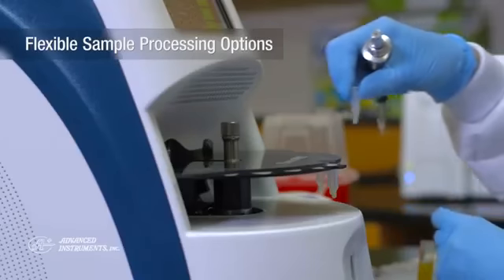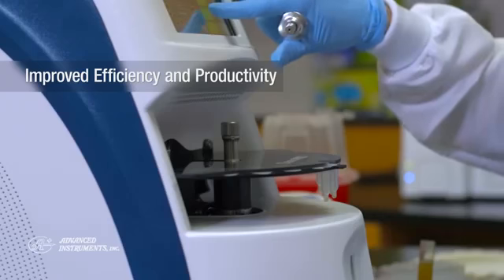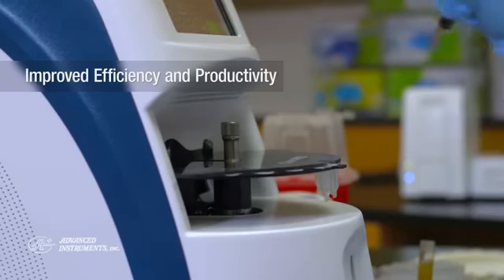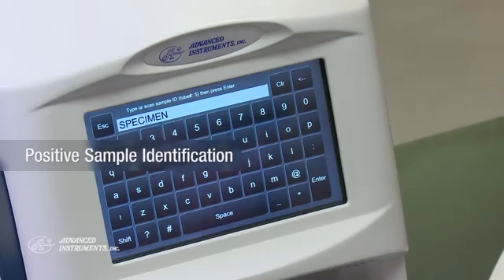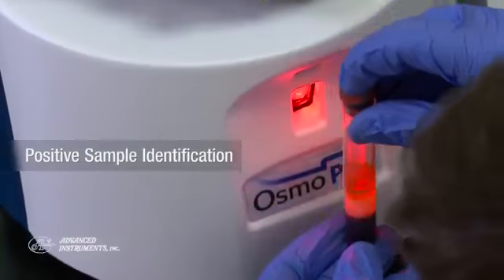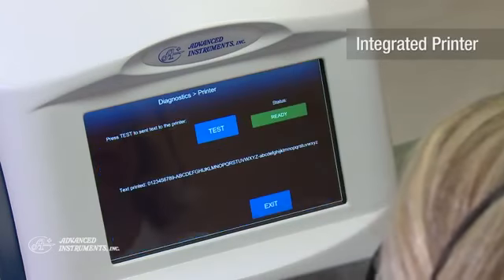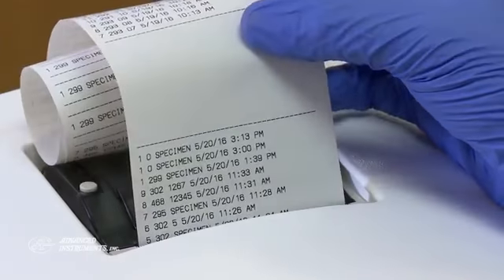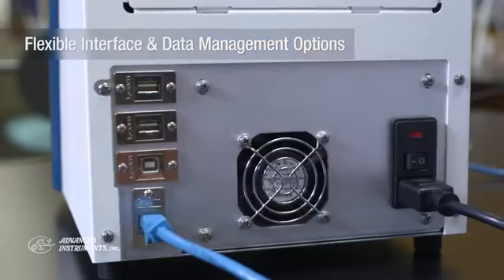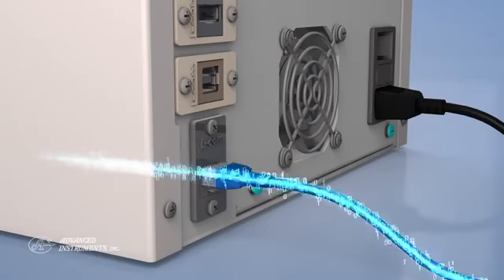With these flexible sample and batch processing options, you can expect improvements in efficiency and productivity. An integrated 2D barcode scanner provides sample identification, which reduces transcription errors. An onboard printer allows for easy printout and archiving of test results. An ethernet connection allows for simple and flexible LIS interface options, and multiple USB ports allow for easy export and improved data management.